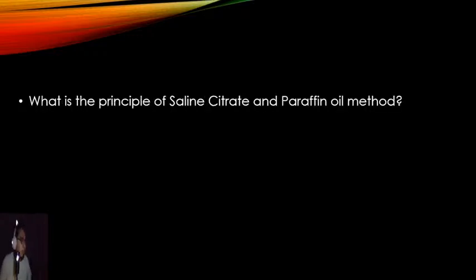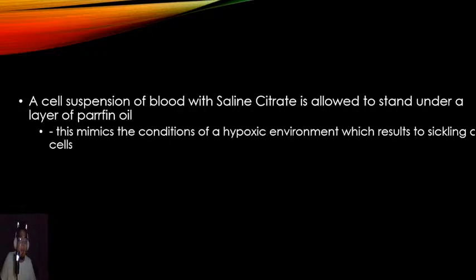Okay, so what is the principle of saline citrate paraffin test? Well, the cell suspension of blood with saline citrate is allowed to stand under a layer of paraffin oil. Okay, and then this mimics the condition of a hypoxic environment. Remember my story yesterday about my coworker who has a kid that had sickle cell disease and thalassemia trait.